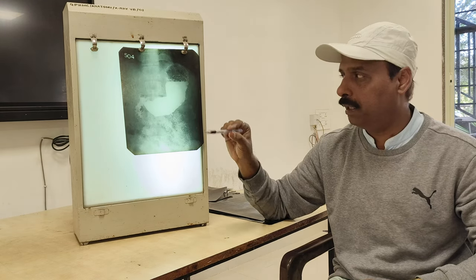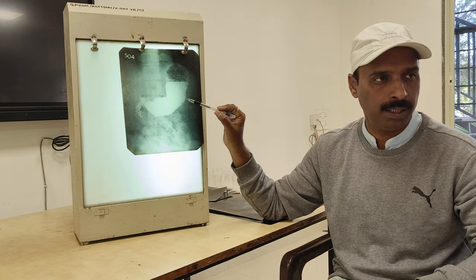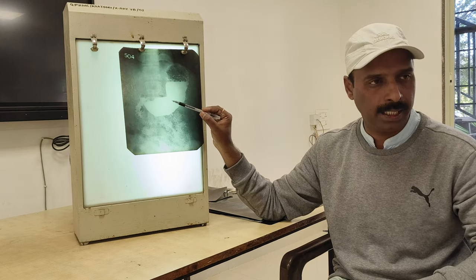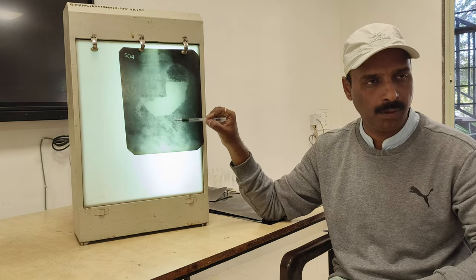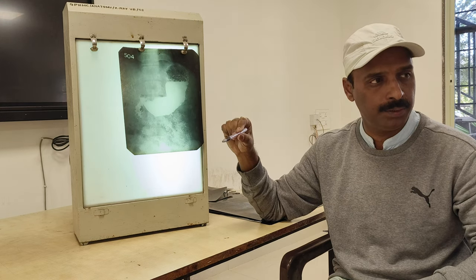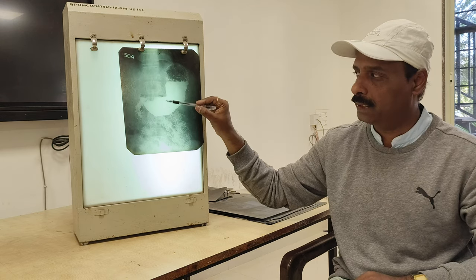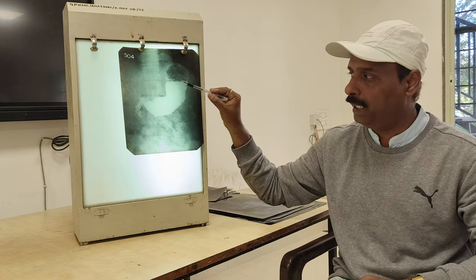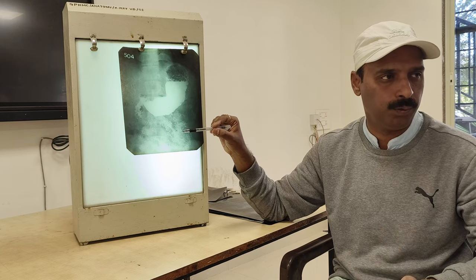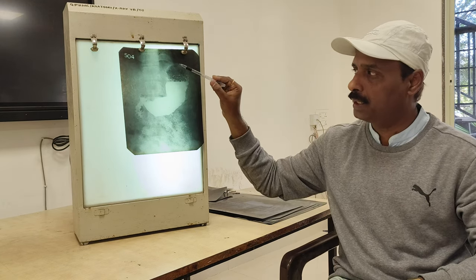How are you going to read this x-ray? You have to read that this is a contrast or special x-ray. It is one of the contrast varieties of x-ray. The contrast media used is barium sulfate, and the x-ray is taken after the barium meal and barium follow through. So you have to read what structures are seen here.